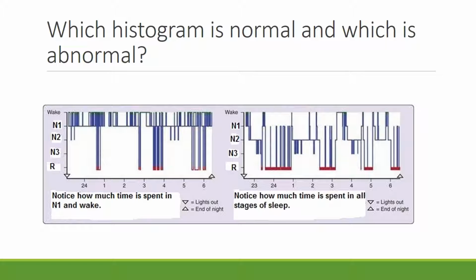Okay, so let's compare the two. Starting at the picture at the left, notice how much time this person spent in stage N1 sleep and awake. They did get some REM sleep, but I don't see any time spent in stage N3.